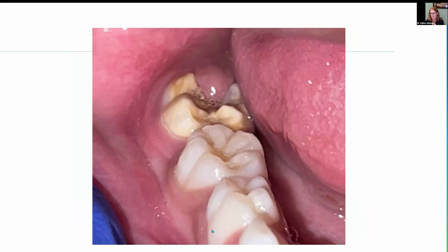We don't want that. Here's another situation. This is a really interesting one, and I will be completely honest with you. I do a ton of restorative. I generally use a raincoat for restorative. And in a tooth like this that is already sensitive due to molar hypomineralization, I will get a raincoat on that thing, and I will flip that operculum back, and I will try to help this child out restoratively, because there's a couple things I know.